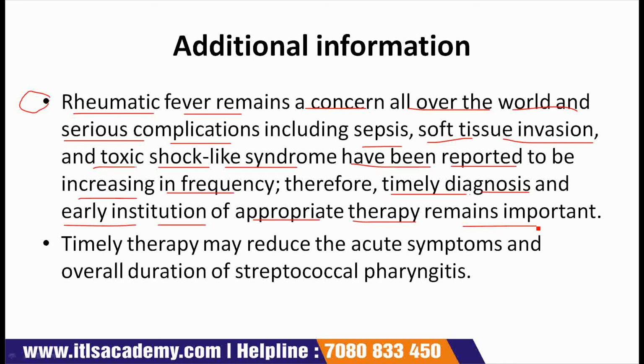Although a throat culture is a highly reliable way to diagnose strep throat because it has a sensitivity of 90 to 95%, it is not used as commonly as the rapid antigen test because throat culture results are often not available until 24 to 48 hours later.